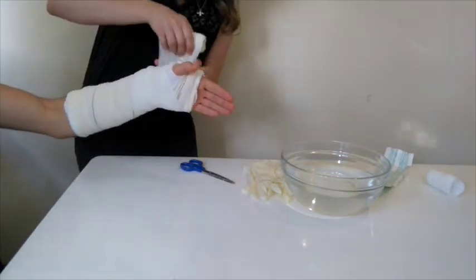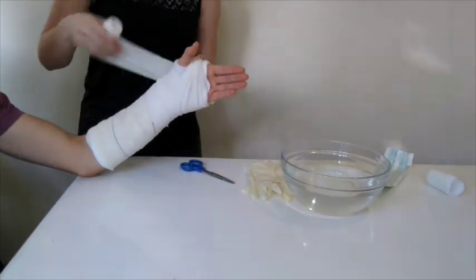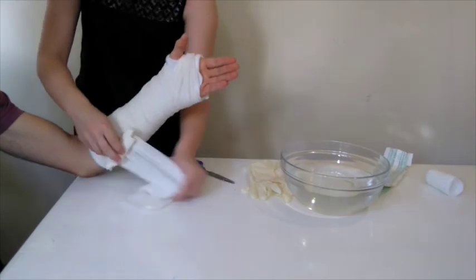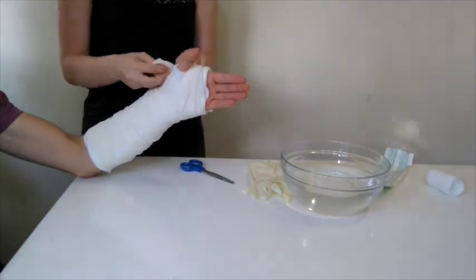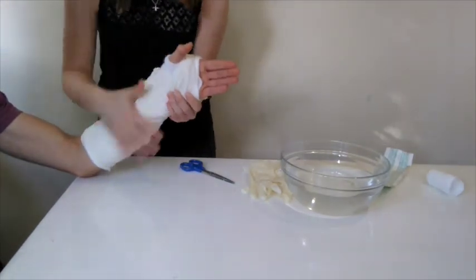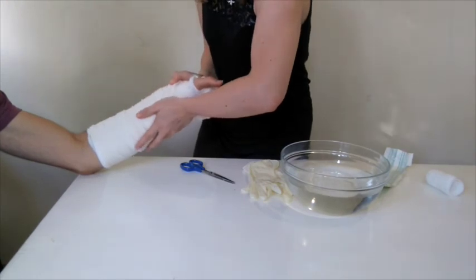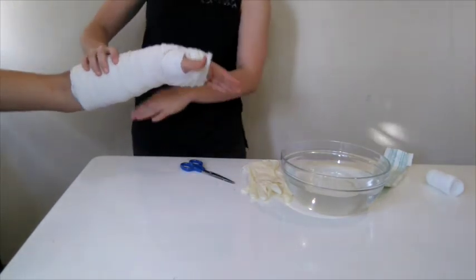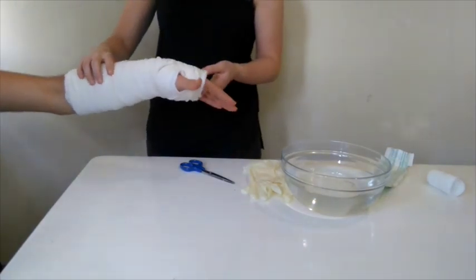The wrist should be slightly flexed and ulnar deviated. Please note that the patient's wrist in this video is too flexed and with too much ulnar deviation. After application, an x-ray needs to be done to ensure that there is adequate reduction. It is also important to do a neurovascular examination of the limb after cast application. The patient must be instructed to keep the cast dry, keep the limb elevated, and to return if they experience any pain, swelling, discolouration of the fingers, or any discharge or offensive smell.